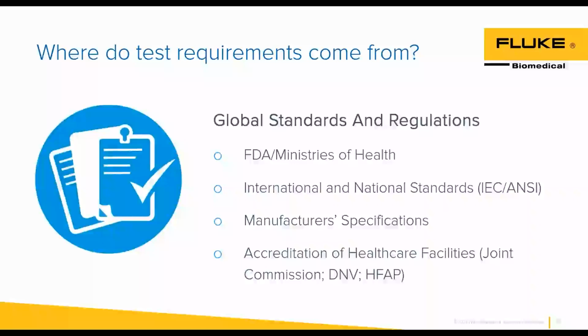I know we're all aware of the Joint Commission when they come into town. With that, the medical device testing frequency can also be based on your hospital's policies and procedures, and that's based off maybe a risk score or medical device management plan.